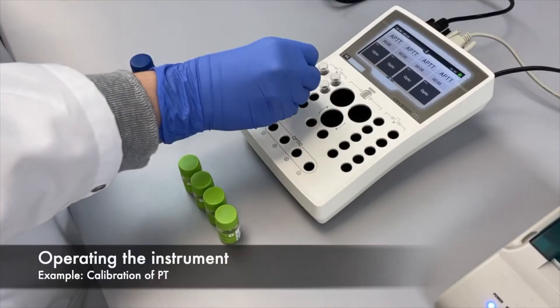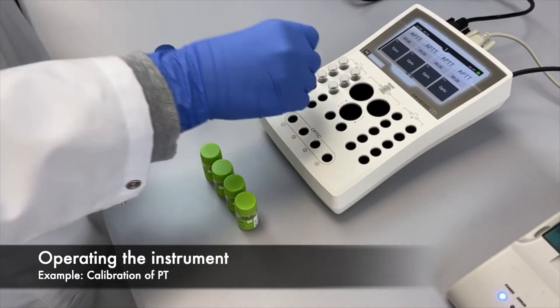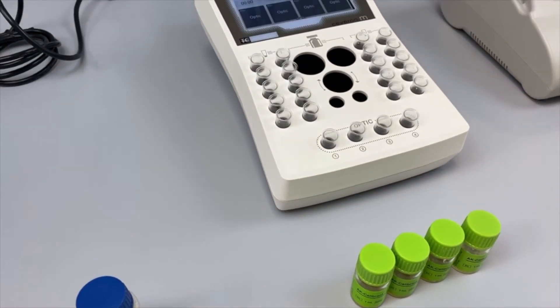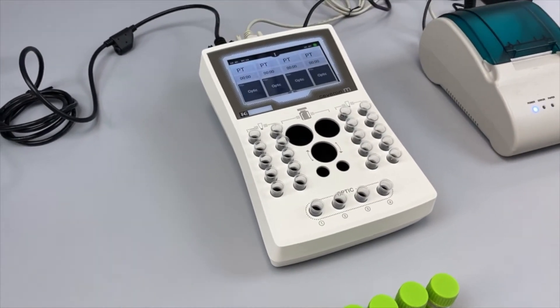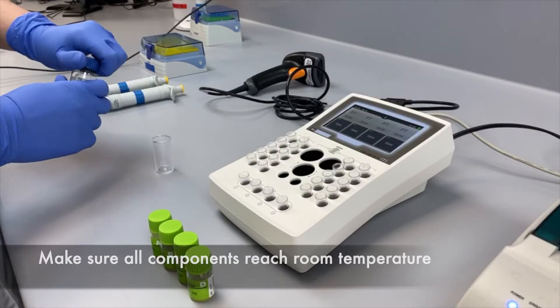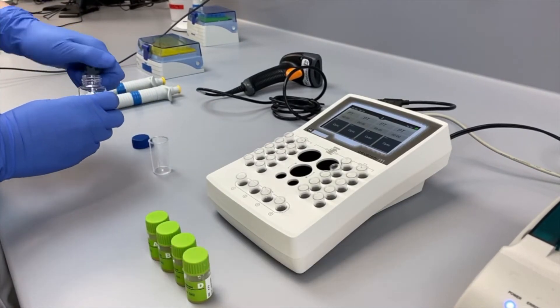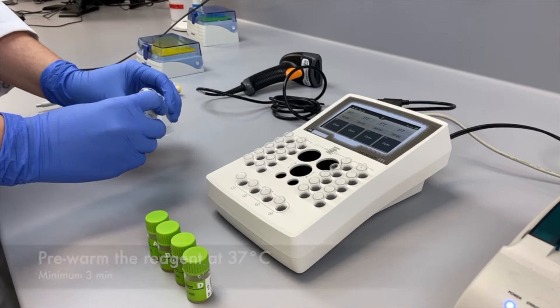The calibration values are stored in the instrument. Using pre-calibrated values from the batch table, you can easily calibrate the parameters yourself. As an example, you see the calibration of our PT Technoplastin HIS combined with our AK-Calibrant set.